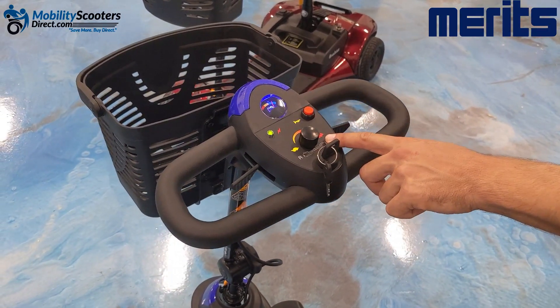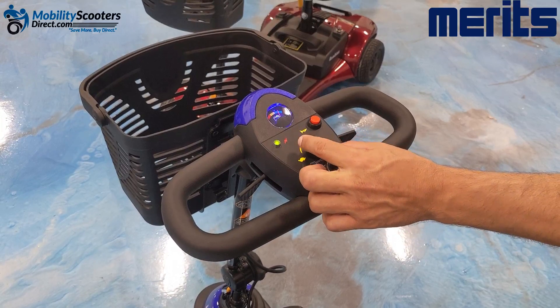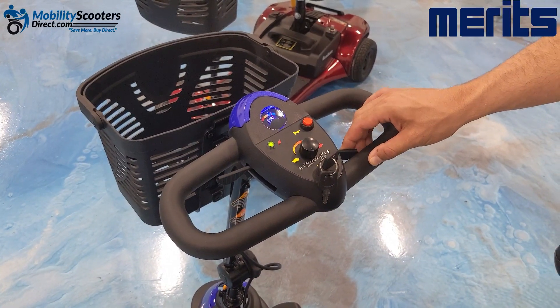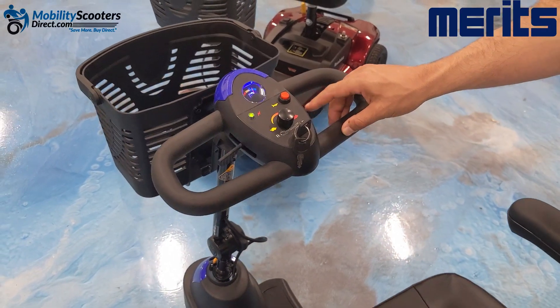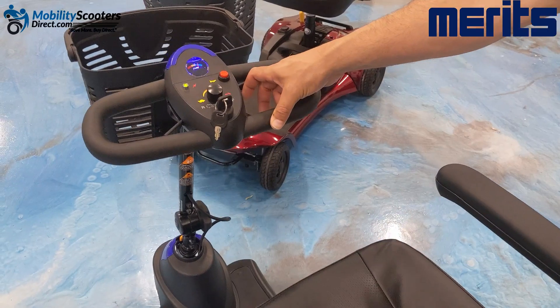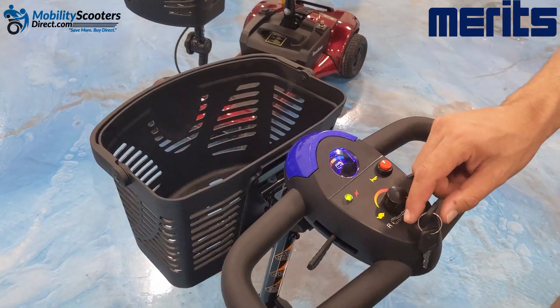The speed control knob works like any other speed controller knob. Counter-clockwise makes the unit slower; rotating the dial to the right — clockwise — makes it faster. We do recommend starting off using this scooter in the slow position until you get used to it.